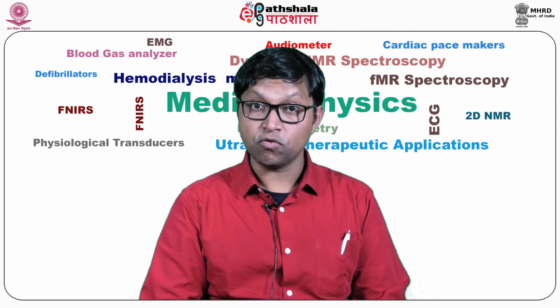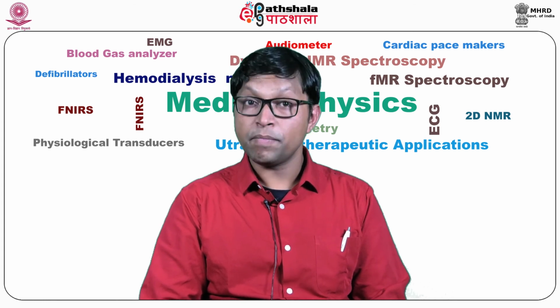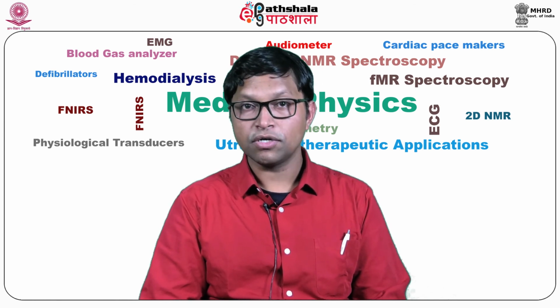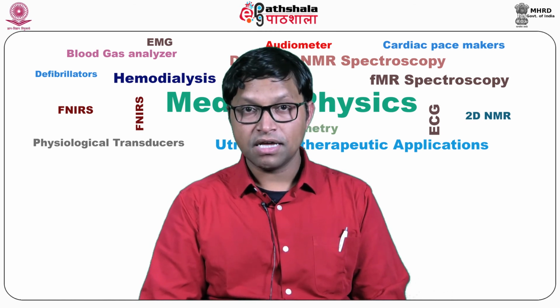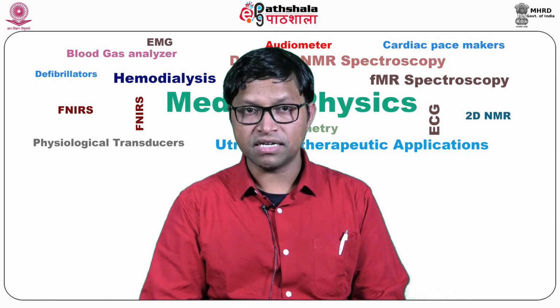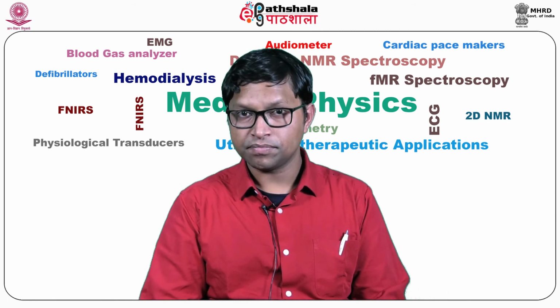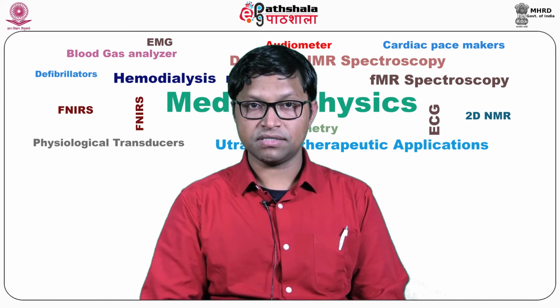One is the movement of the cables. Second, the movement or momentary loss of the skin electrode contact, causing a motion artifact. The third point is fluctuation of the charge distribution on the skin and the connecting cables. And the final point is the power line interference.